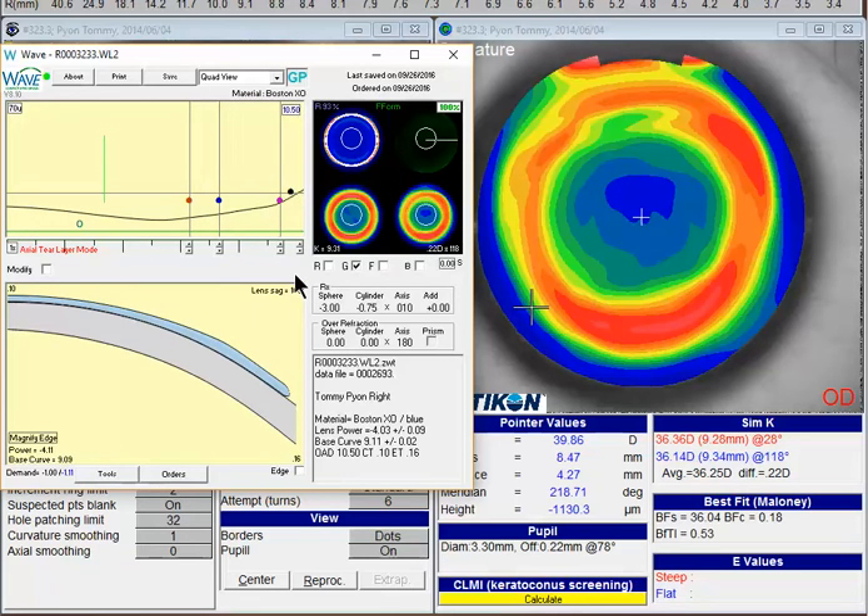Ideally you want to get the landing zone to line up a little bit more accurately with this red area into the flatter blue peripheral cornea.